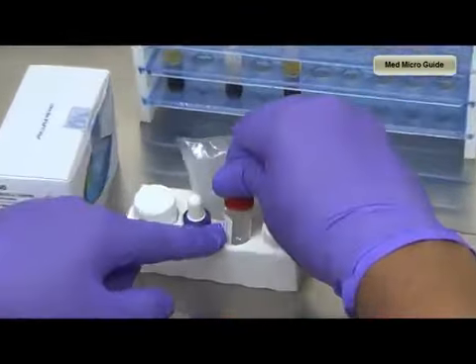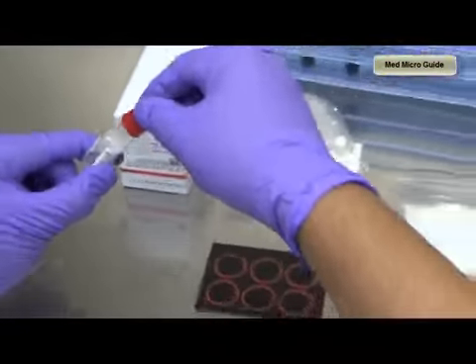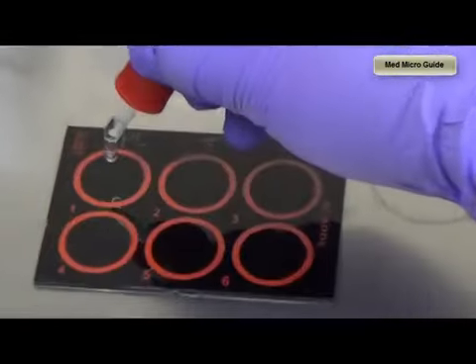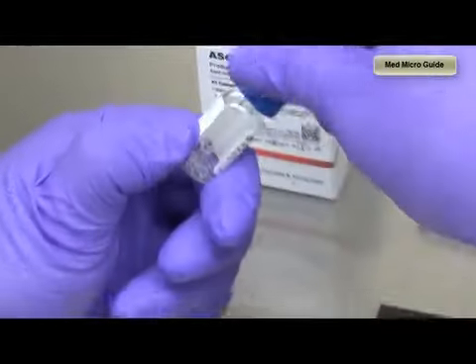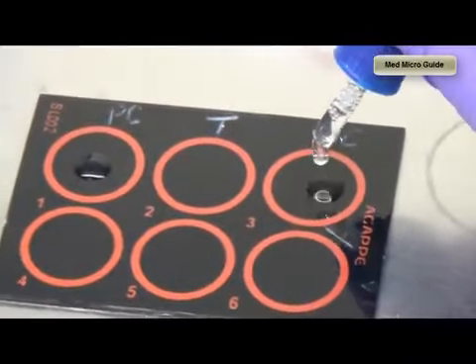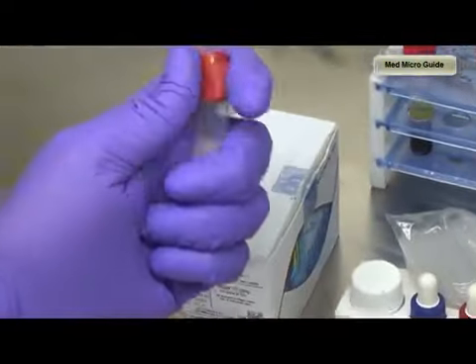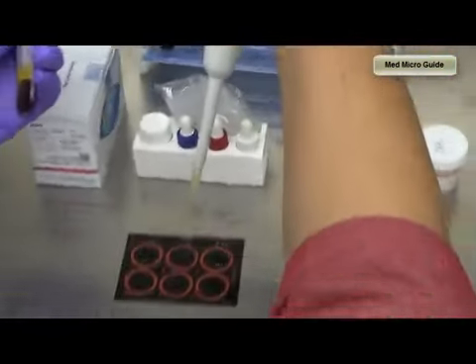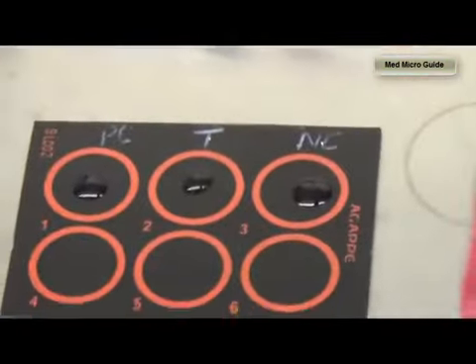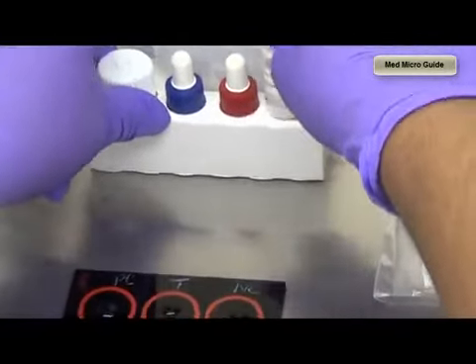The slide is labeled for positive control, negative control and test sample. Now we will add one drop of positive control to the well and a drop of negative control. We will add a drop of serum, or we can add the volume of serum as described by the kit literature. In this case, I am adding 50 microliters of the test serum.